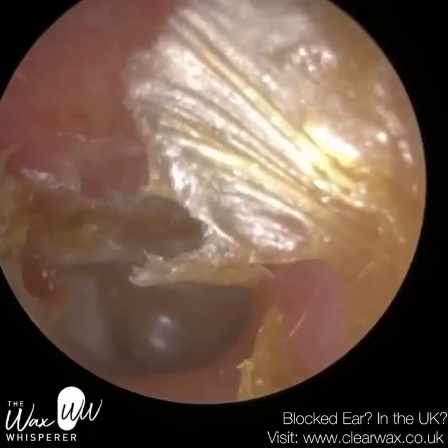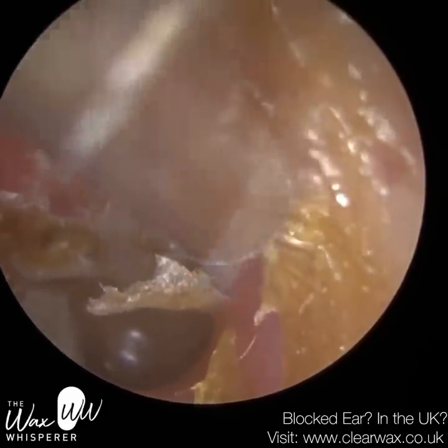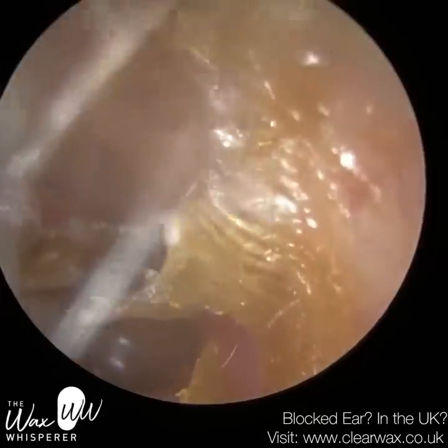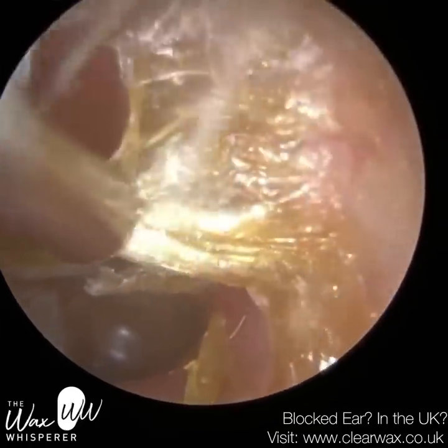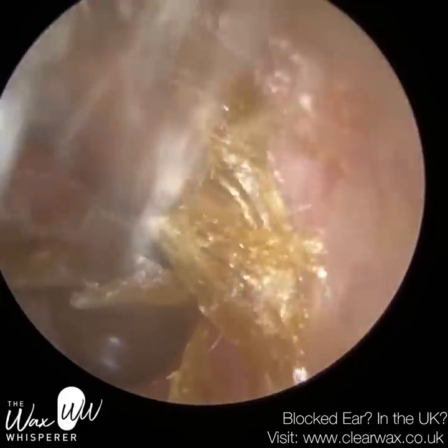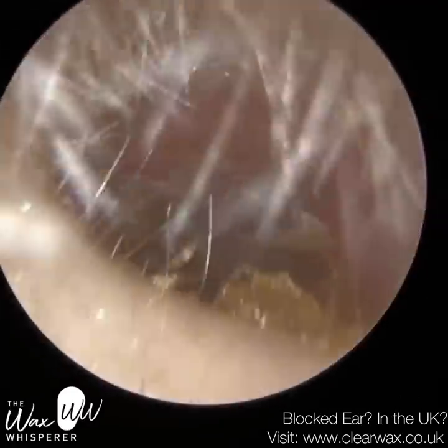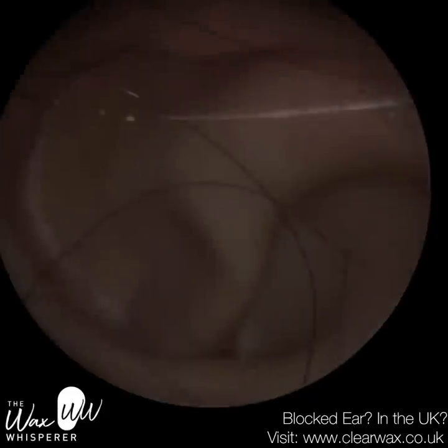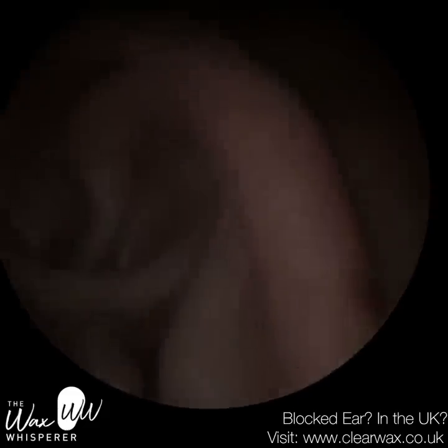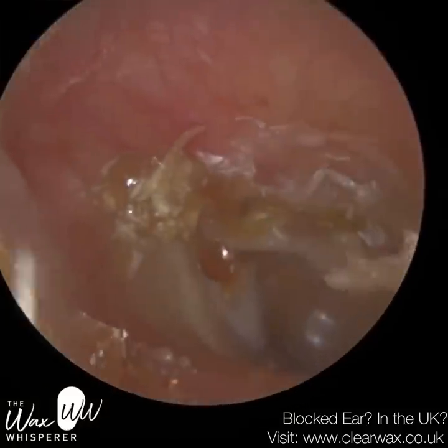When the eardrum is sucked in, it creates a pocket for dead skin to collect and accumulate. And that dead skin, if unremoved, can form into a cholesteatoma — a cyst of dead skin that's self-growing. It can be quite destructive. It can grow into the middle ear, towards the brain upwards, and posteriorly towards the mastoid bone, potentially causing mastoiditis. Untreated, that cholesteatoma can potentially be life-threatening.